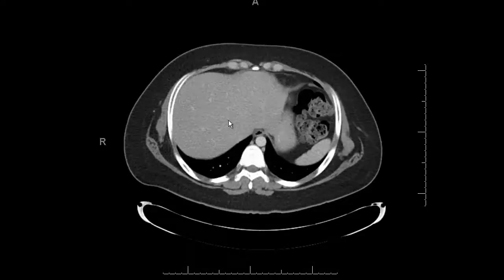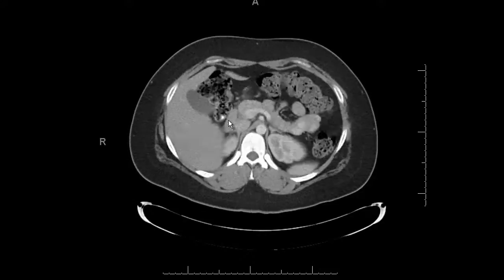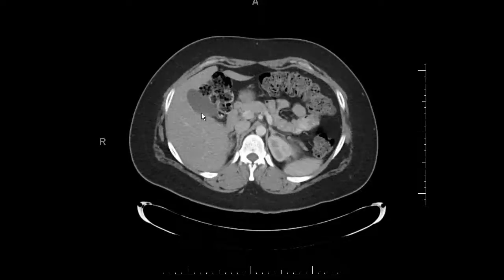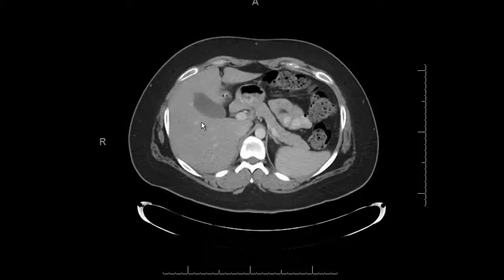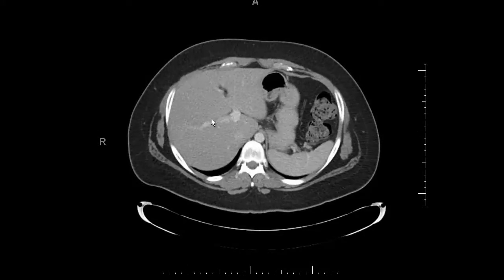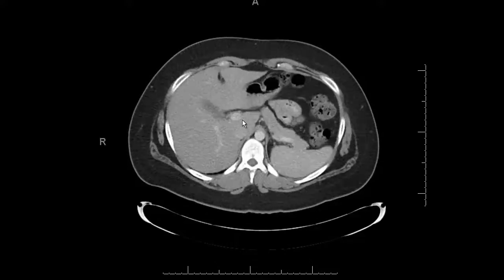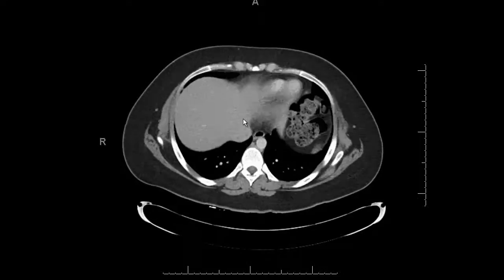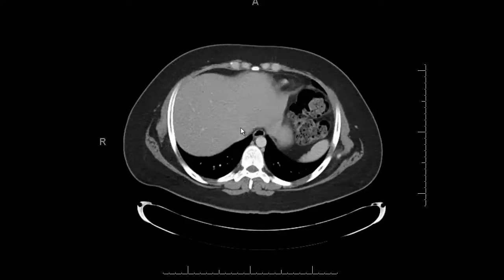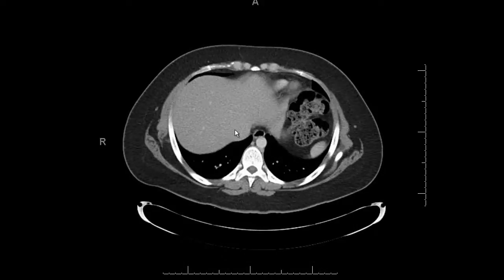Then I scan through the liver and look for any masses or abnormal cysts. While doing that, I'll also look at the gallbladder and check for ductal dilatation. Make sure to look at the portal vein — here's the left portal vein, right portal vein, main portal vein, and the hepatic veins, which drain into the IVC. Depending on the phase, the hepatic veins may be difficult to see, moving in a three-pronged pattern toward the IVC.